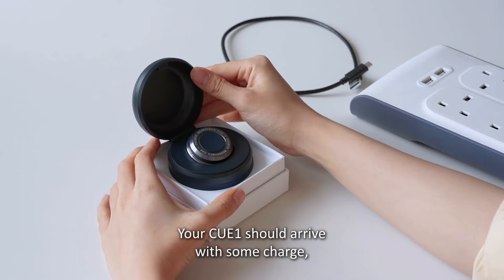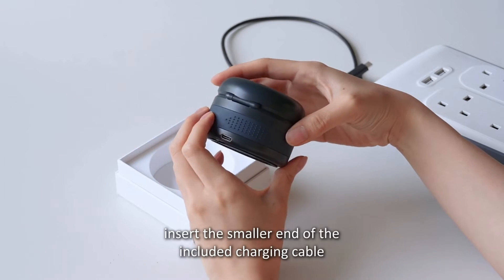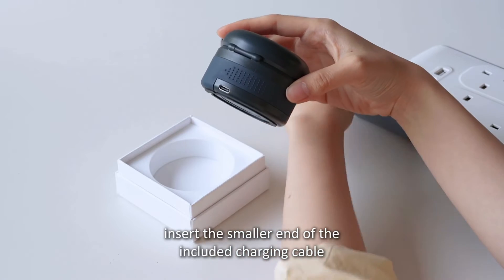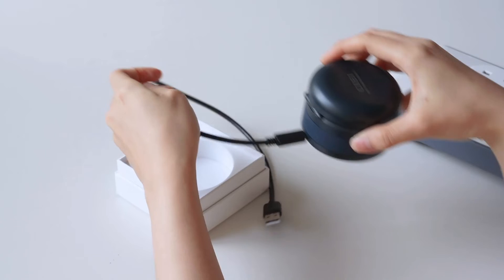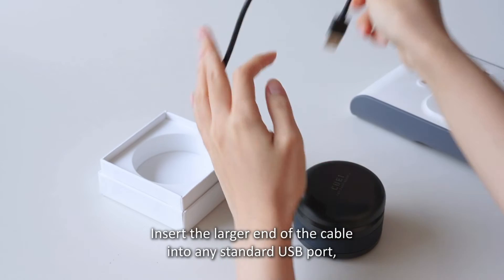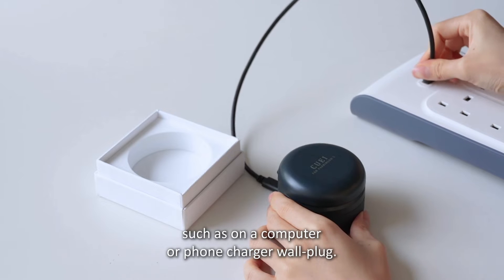Your CUE1 should arrive with some charge, but you may wish to top up the battery. To charge your CUE1, insert the smaller end of the included charging cable into the port on the rear of the dock. Insert the larger end of the cable into any standard USB port, such as on a computer or phone charger wall plug.